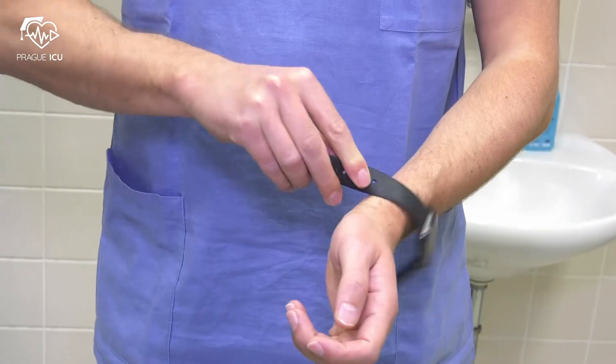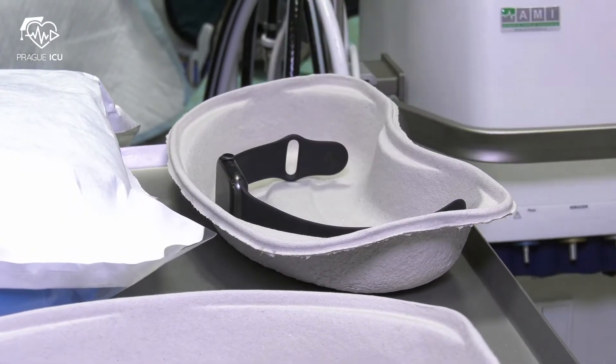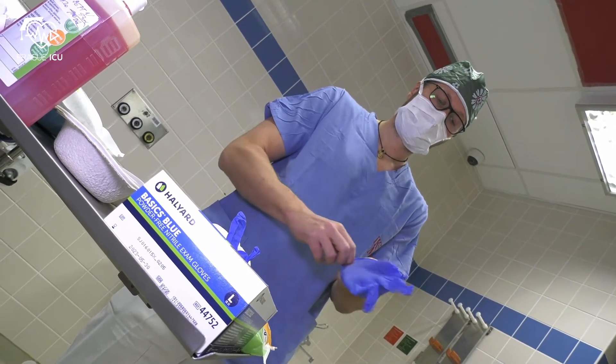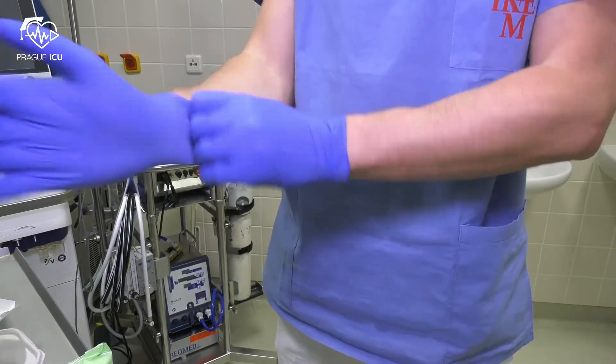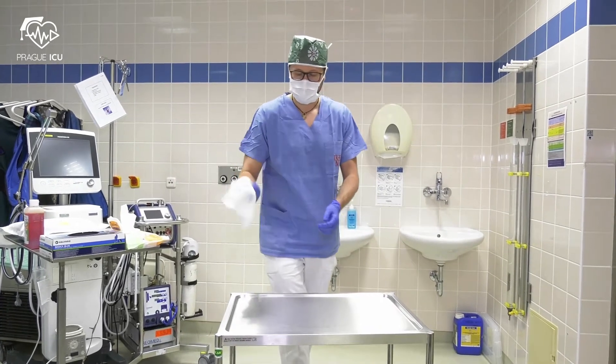Before scrubbing up, have your head and face mask on. Remove watch, bracelets or rings. Make sure nothing remains on your hands or arms. Take non-sterile gloves and disinfect the instrument stand with a disinfectant wipe.